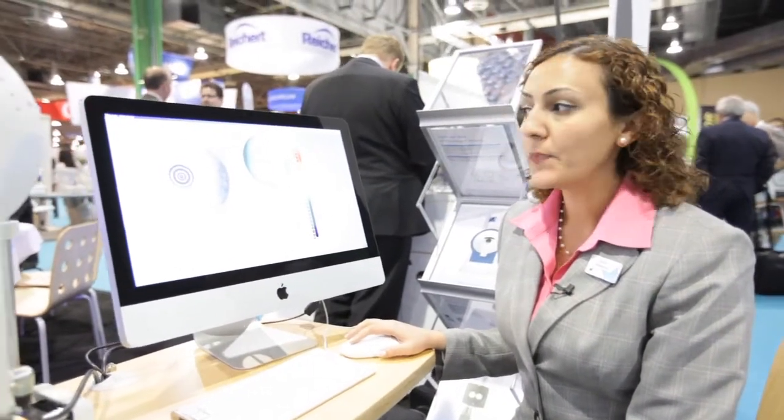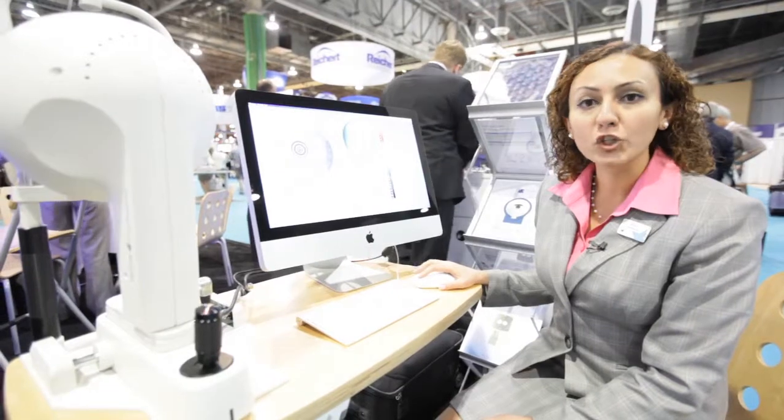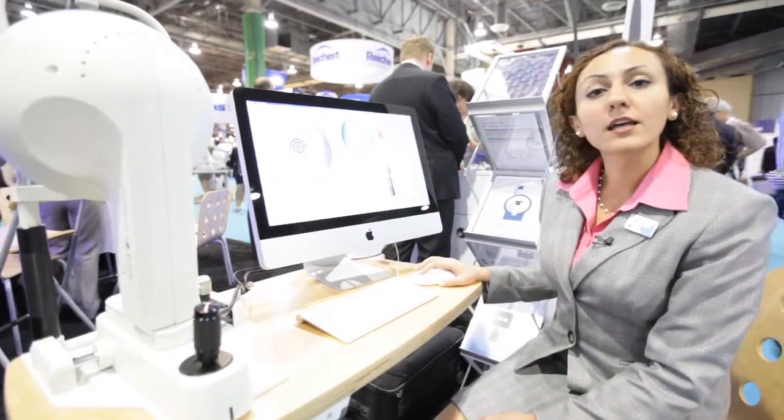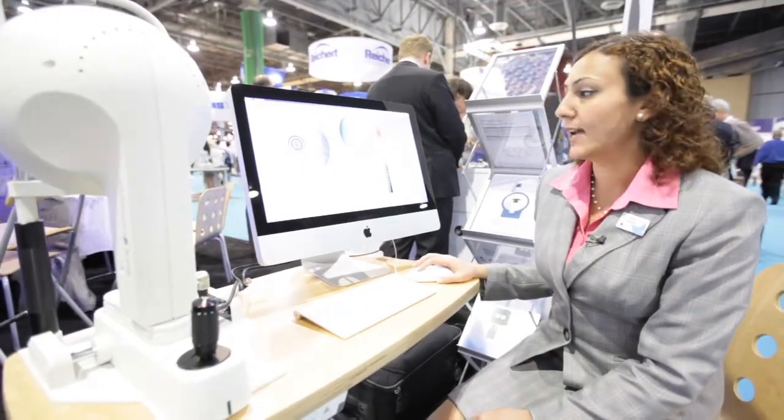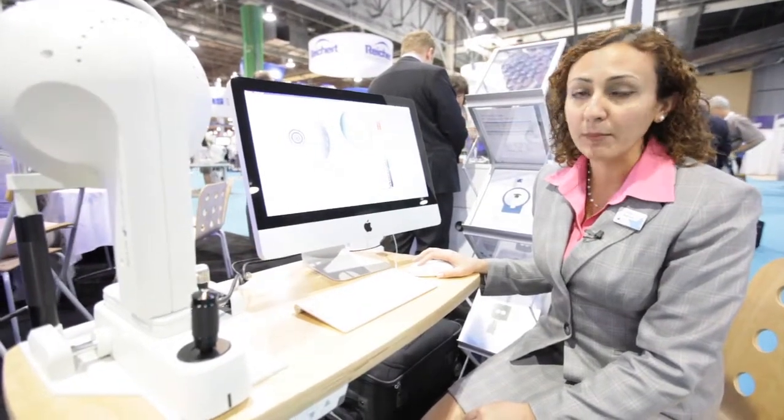This is the Oculus Keratograph topographer. It's a corneal topography system that measures 22,000 points on the surface of the cornea. This machine can also perform real keratometry, and it gives the K value, real Ks at 3 millimeter zone. You also have the Ks at 3, 5, and 7 millimeter zone.